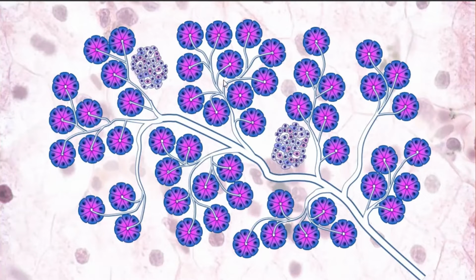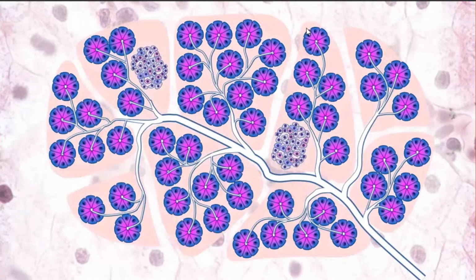Also, pancreas has two parts, structural and functional. Here we can see the epithelial part of pancreas. Its main specific part we call parenchyma. And also pancreas has stroma. There is connective tissue which surrounds groups of acini and islets of Langerhans.